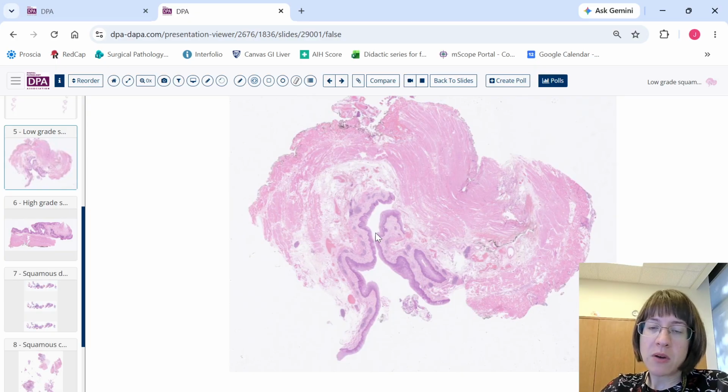So when we're thinking about squamous dysplasia, before we go to the slide, the things I'm going to be looking for essentially are a change in that normal maturation that I was showing you in the previous cases. So instead of having a very thin organized basal layer and then quickly accumulating more cytoplasm, we're going to get expansion in that basal layer. We can also get some jumbliness.